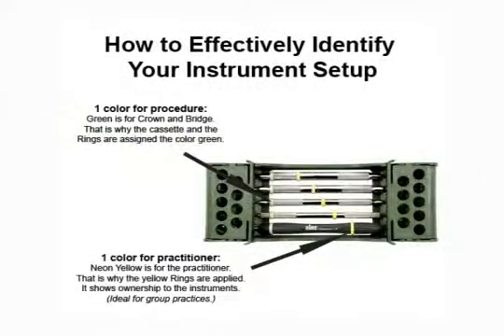Simply place the rings or tape in a V-shaped pattern on the instruments. This setup will identify what procedure they are for and who owns the instruments. The diagonal pattern represents the order in which the instruments are used.